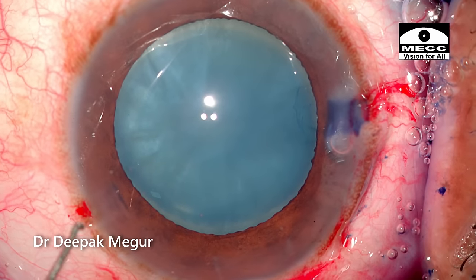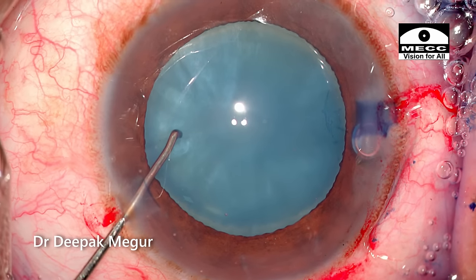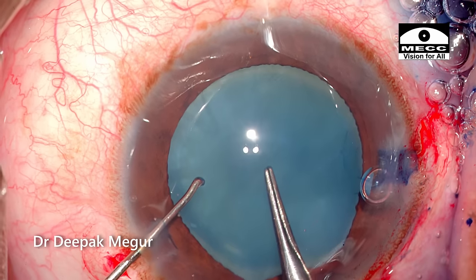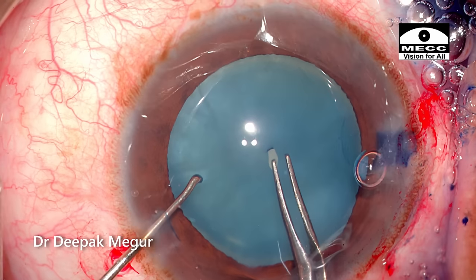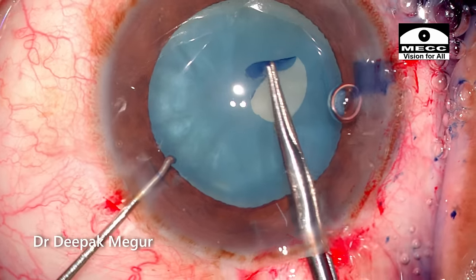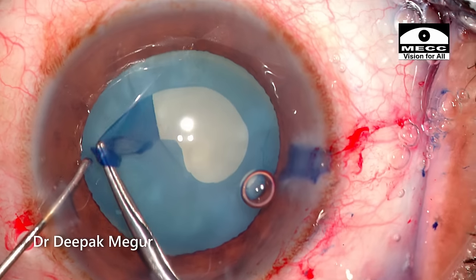Let's perform the rhexis now. I have decided to go ahead with forceps for the rhexis since I was dealing with a white cataract. I stabilize the globe with the dialer through the side port and am trying to puncture the anterior capsule with the forceps. I realize it is not puncturing easily and we can see folds on the anterior capsule — predominantly because of the blunt tip of the forceps. Nevertheless, a flap could be raised and the rhexis has begun. I always prefer to have a second instrument at the side port for stabilization, ensuring the globe is always looking up and straight.